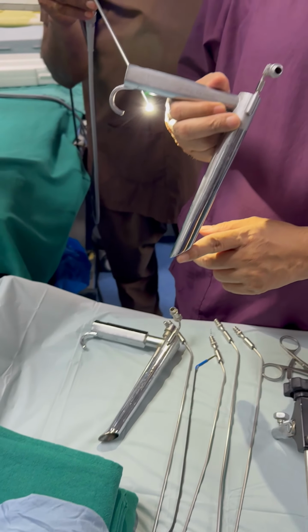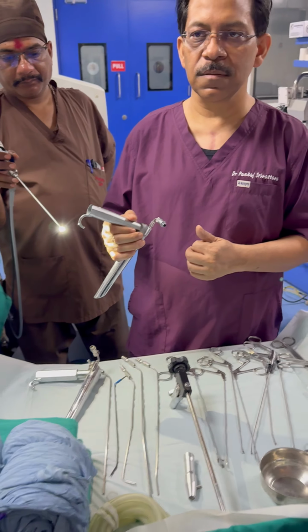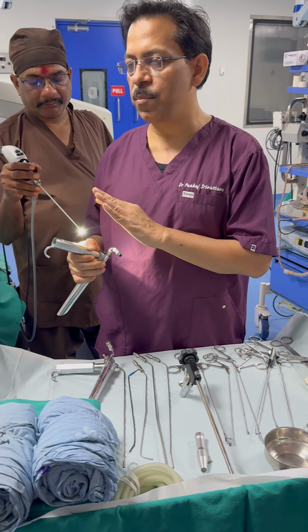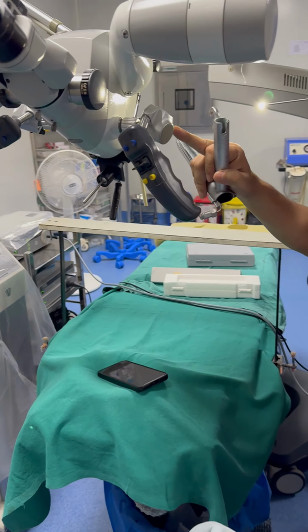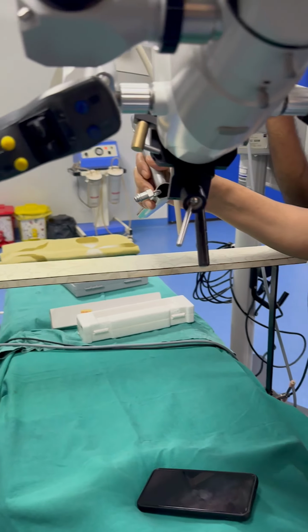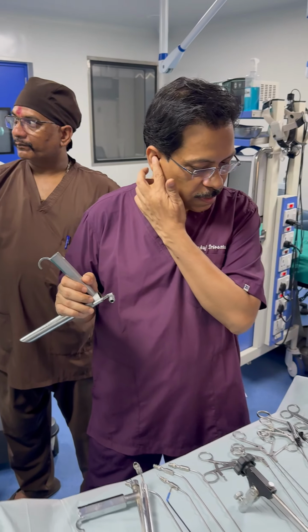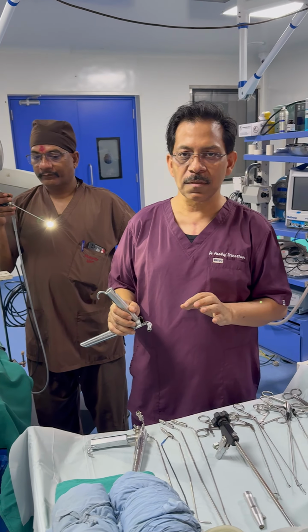So this is a straight one, and when there is a lesion which we can see in the larynx, directly straight lesion is visible, then only lasers can be used. So this is how we use it in laser. The laser is attached, microscope attached. If the lesion is straight visible, this is the only option when we can use CO2 laser, because laser cannot be tilted. So this is not possible when the things are not visible straight. So that option, which is best in larynx, is not used.